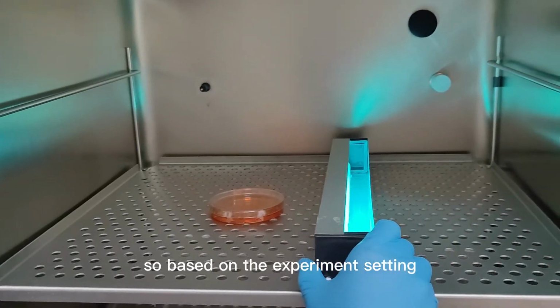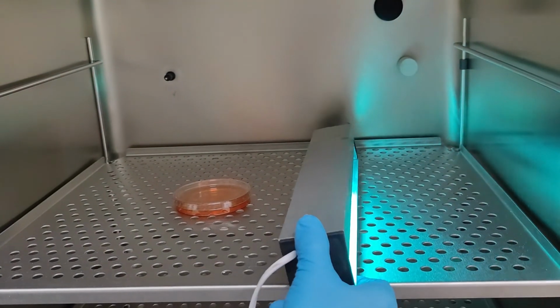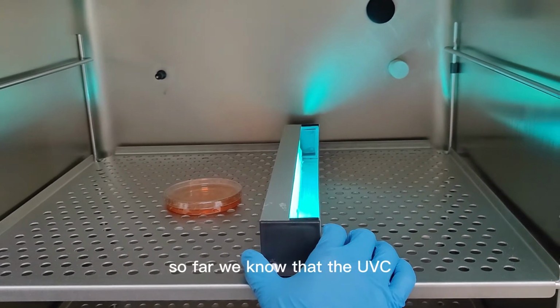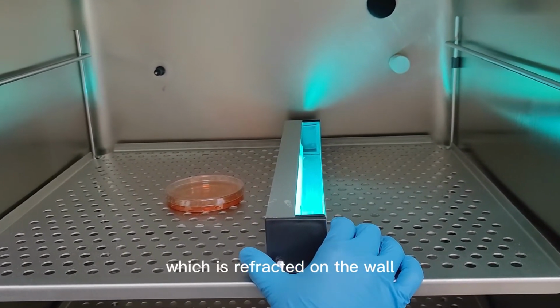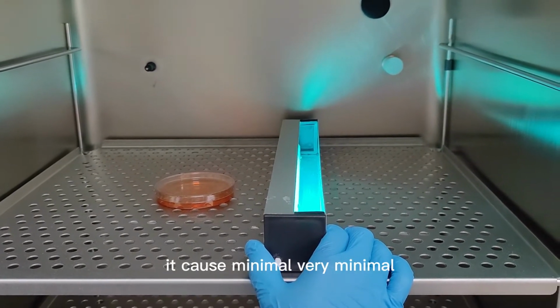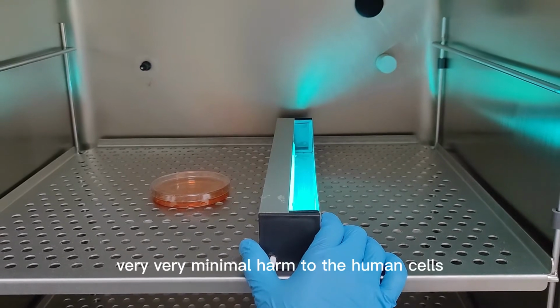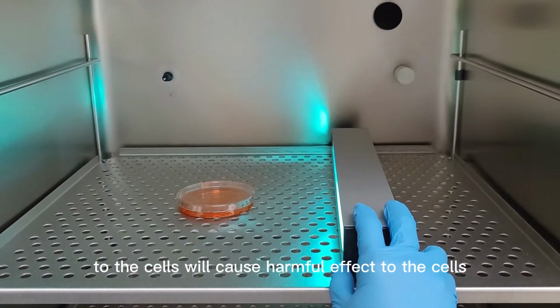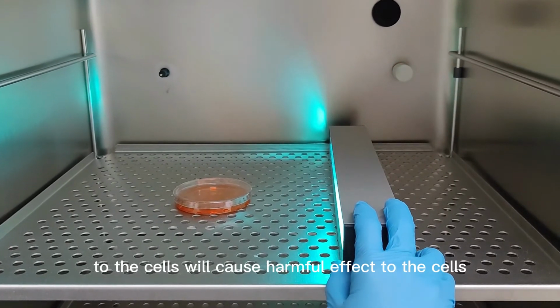Based on the experiment settings 1 and 2, so far we know that UVC reflected on the wall caused very minimal harm to the human cells, while direct UVC to the cells will cause harmful effects to the cells.